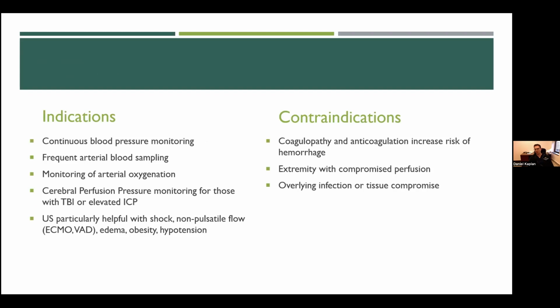So based on this case, we'll talk about indications and contraindications for placement of an arterial line. I think overall, the trend that I've noticed is that we're going a little bit away from putting arterial lines in all of our intubated patients. If you look back years ago, that's how the practice was. Now we tend to do it less frequently.